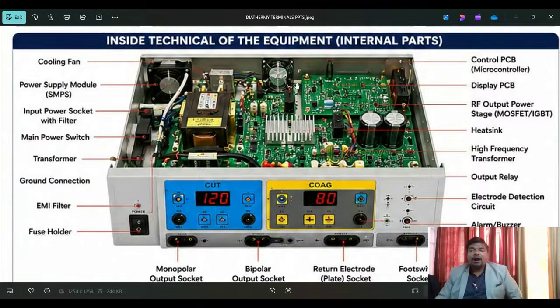Next, see, all components get damaged when you are not using a UPS. If you use raw power supply, AC power should come at 220 to 240, but it may not come that much, and sometimes it comes at more than 250 volts, otherwise 300. Sometimes fluctuations will come, and that time this equipment will immediately get damaged. So that is the fluctuation. My advice is you have to keep UPS connections.